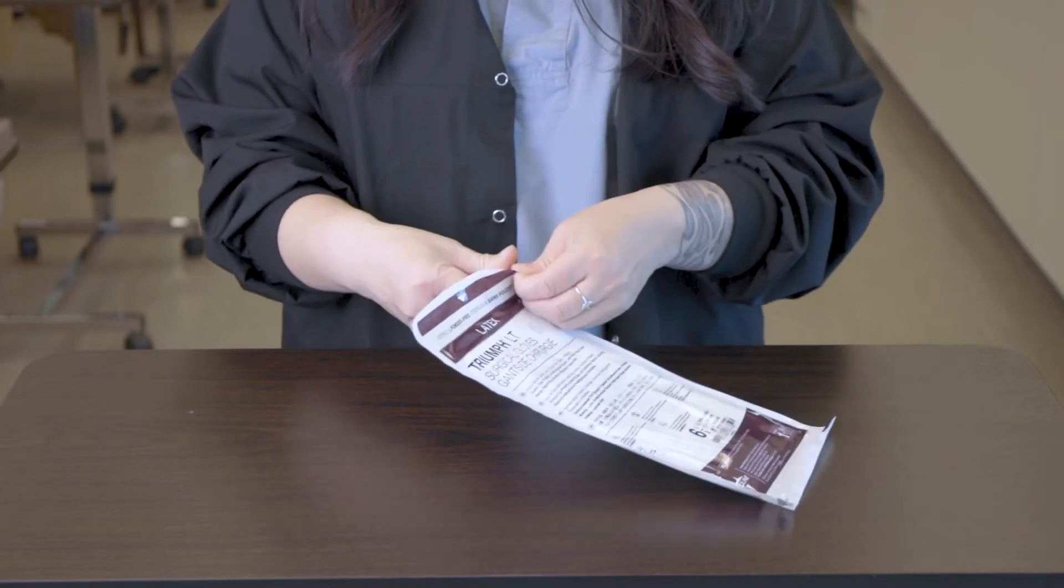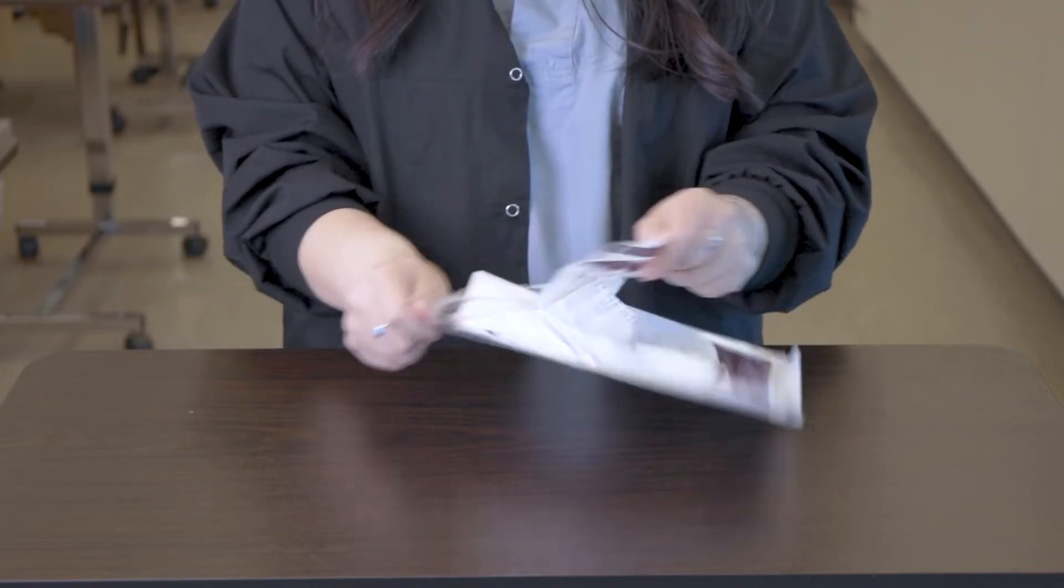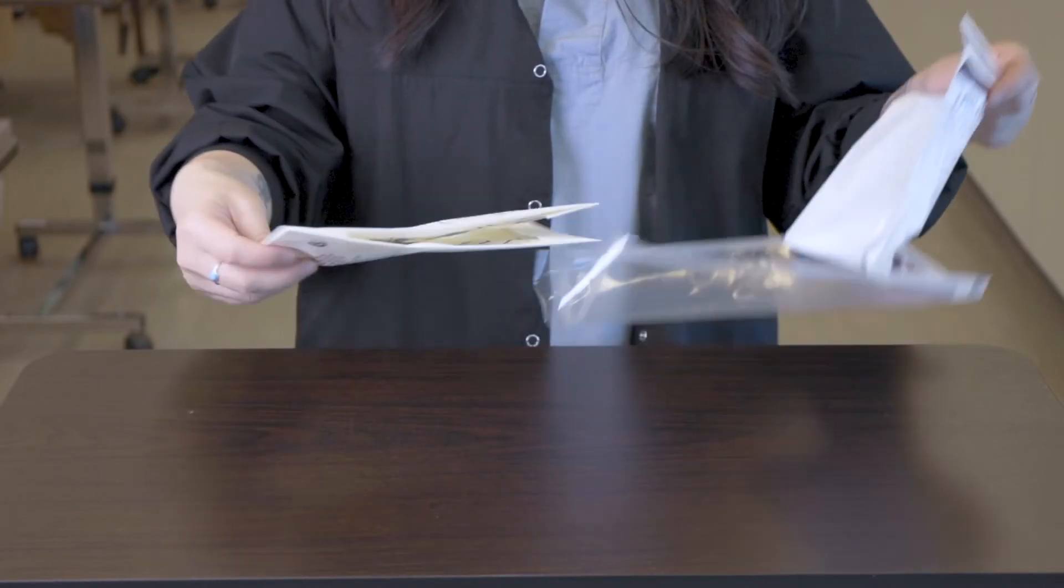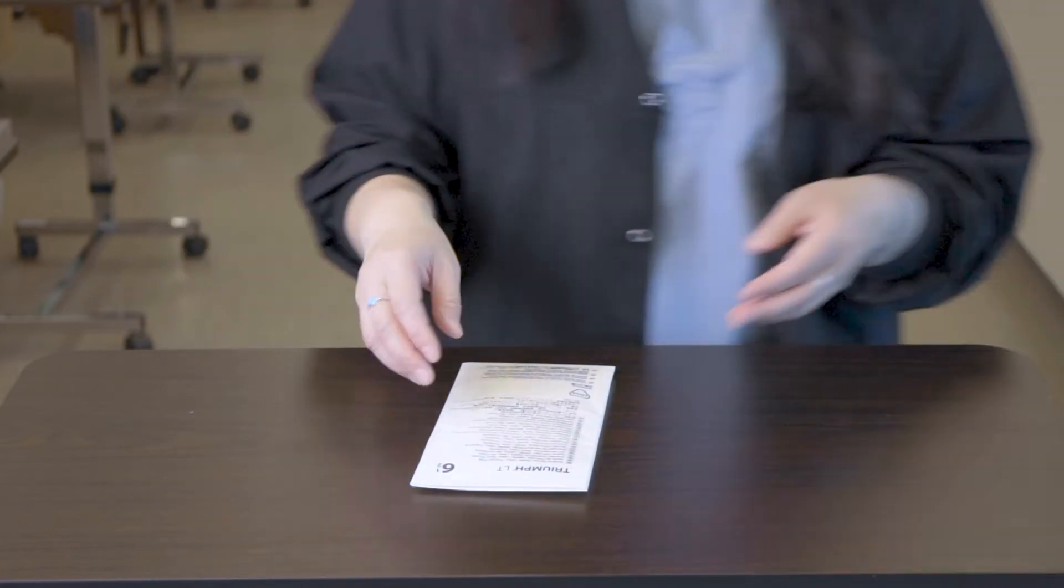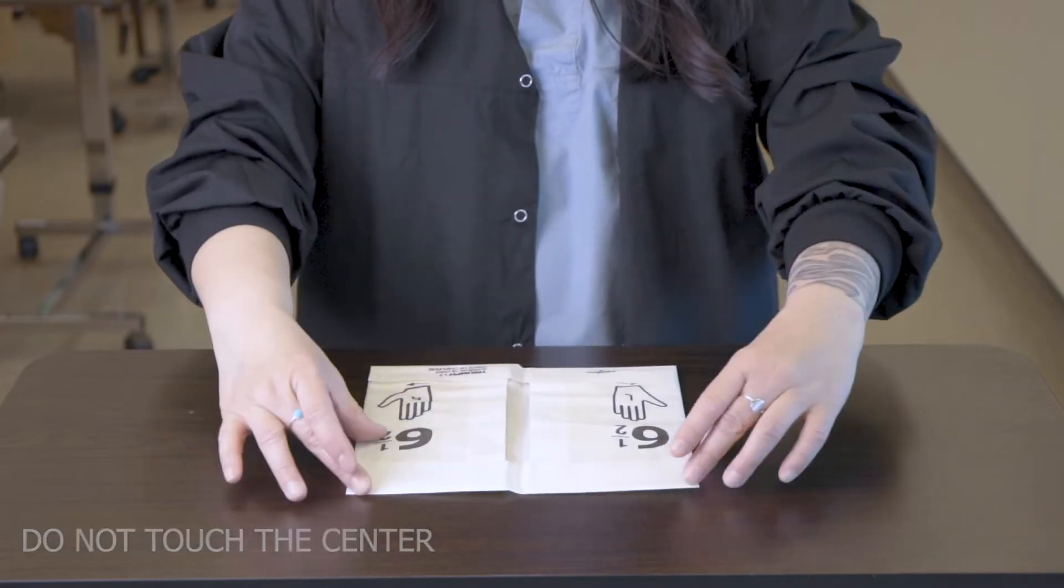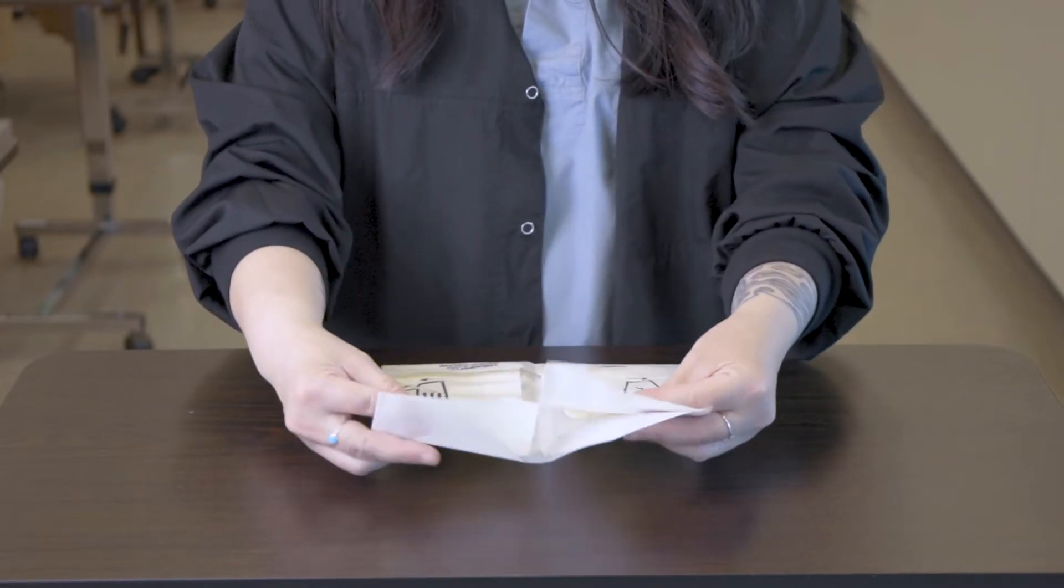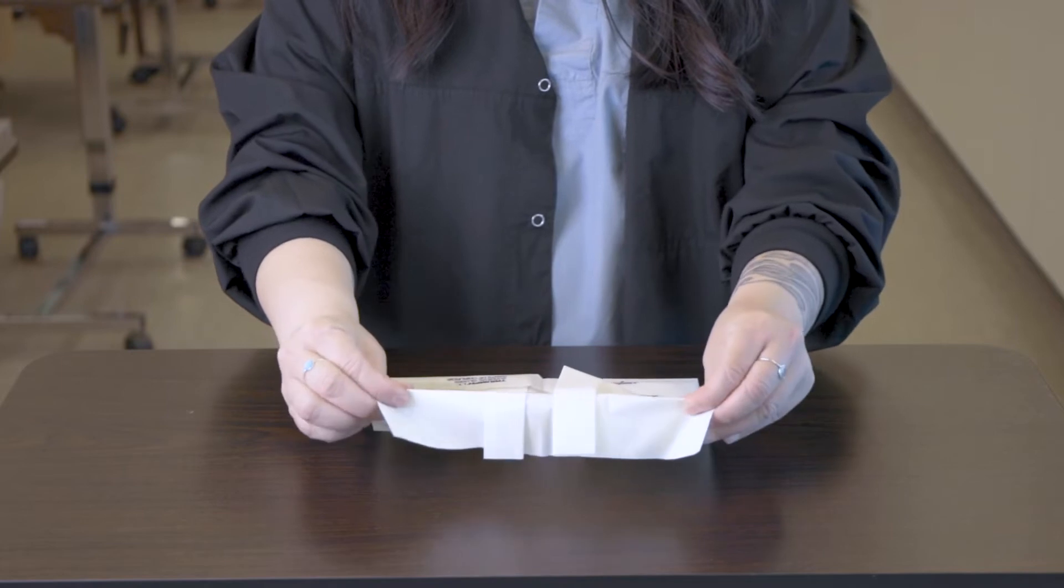Now I'm carefully opening the outer package and disposing it. Then I'm opening the inner package, carefully avoiding the exposed center. I like to gently pinch at the folds to help the package stay open.